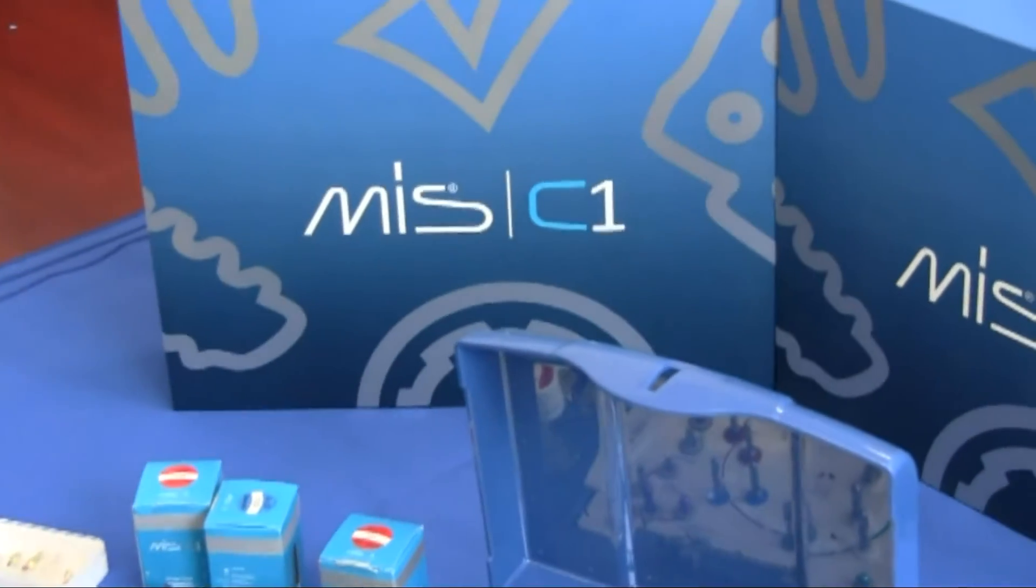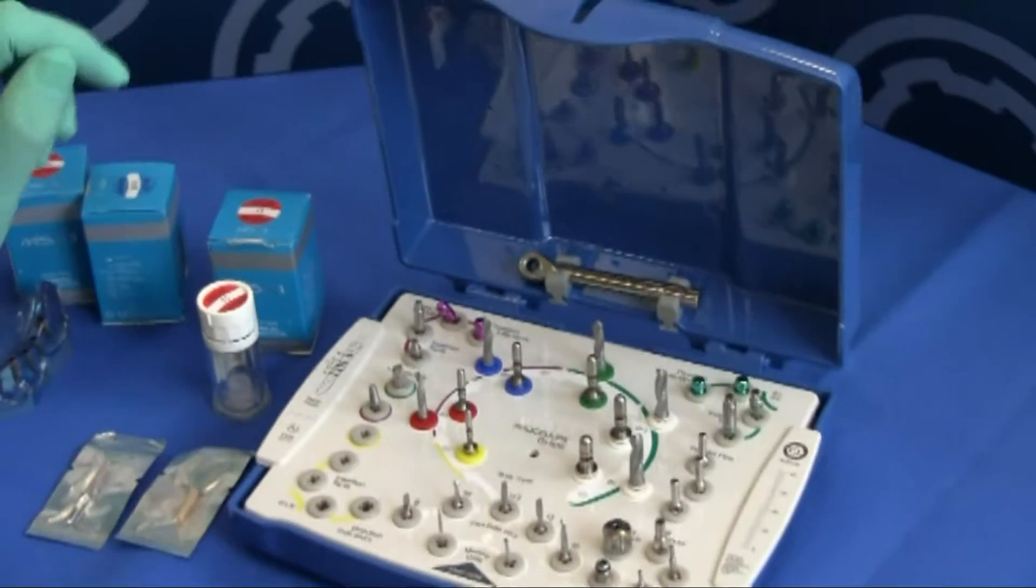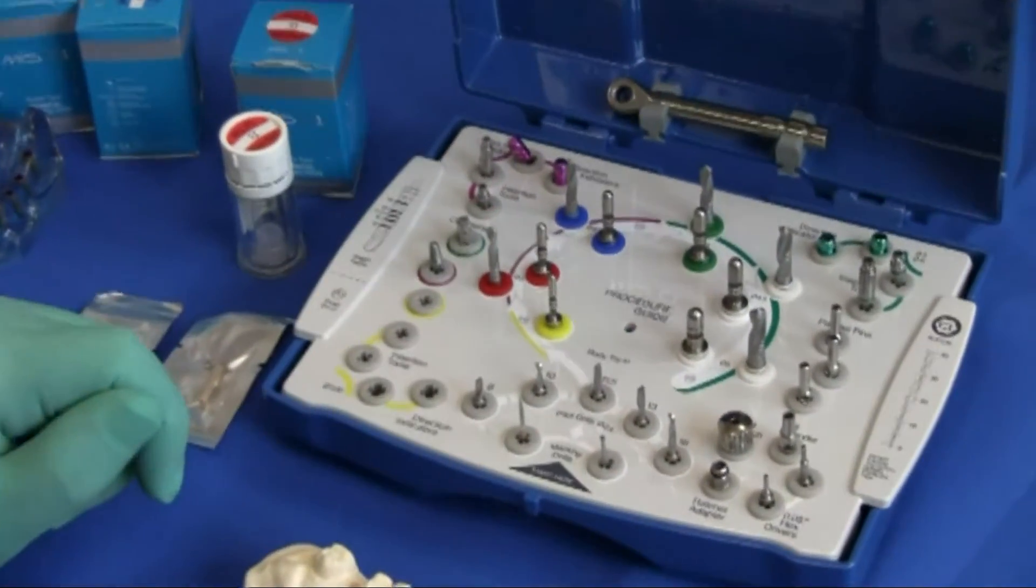Today we are going to show how to use the C1 Surgical Kit to place a C1 implant. Please see our C1 Surgical Kit explanation video for more details about the tools and the whole process.